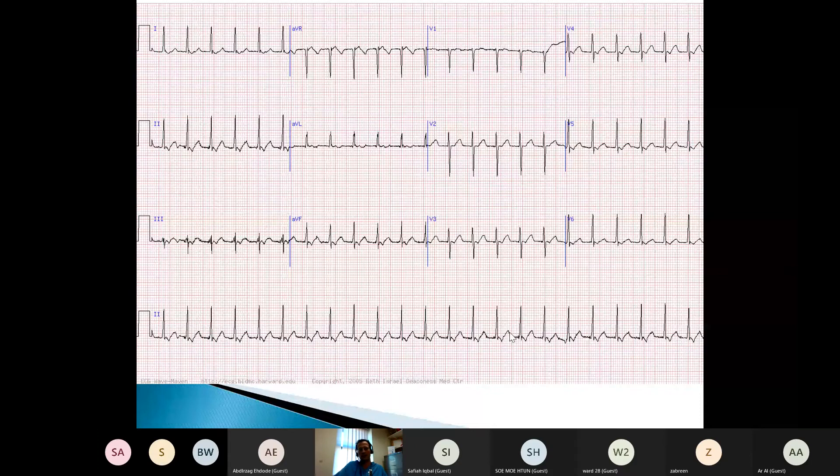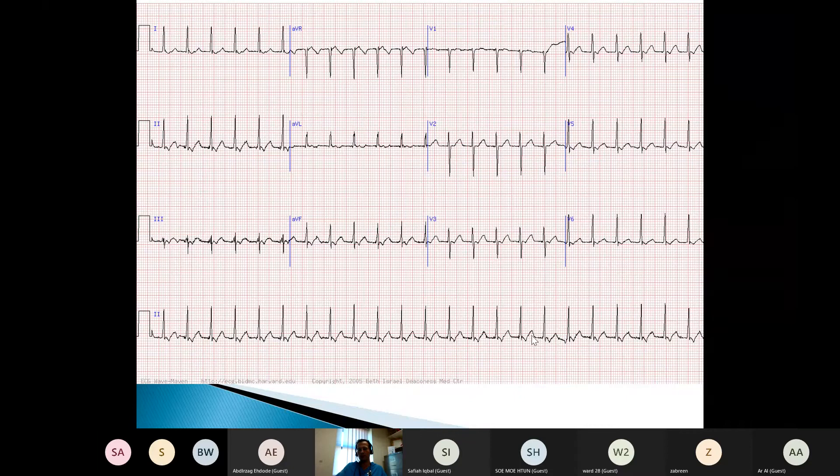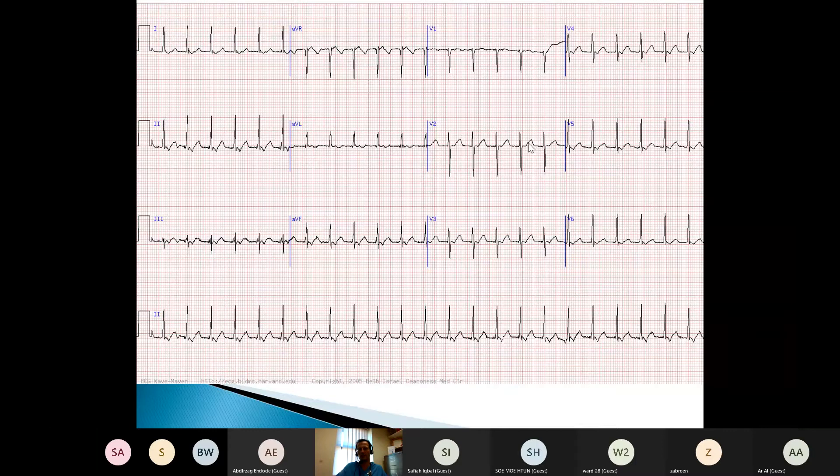I think that everyone's going to be happy that this is a narrow complex tachycardia. Now the next question is: what is causing this narrow complex tachycardia? There are obviously lots of possibilities, one of which is sinus tachycardia. Sometimes P waves can become merged with the T wave because of the tachycardia, but there'd have to be quite a long PR interval for that. Can you see the T wave is symmetrical? There's no suggestion that it's lopsided because of a P wave on top of it. So I doubt this is a sinus tachycardia on that basis.